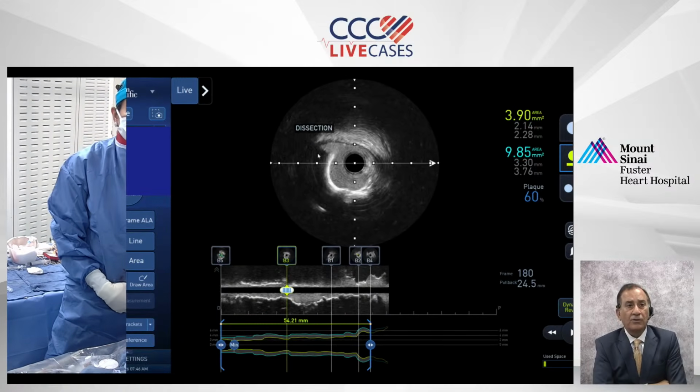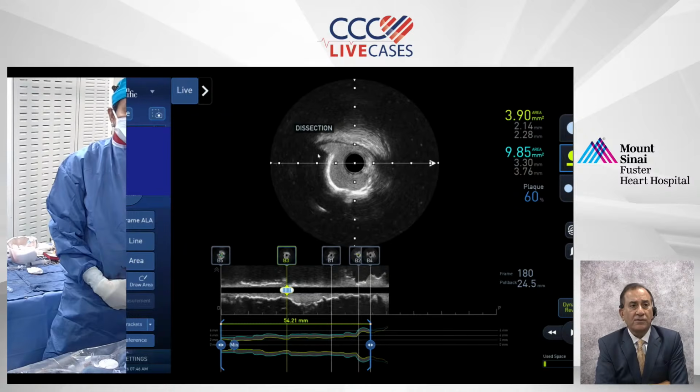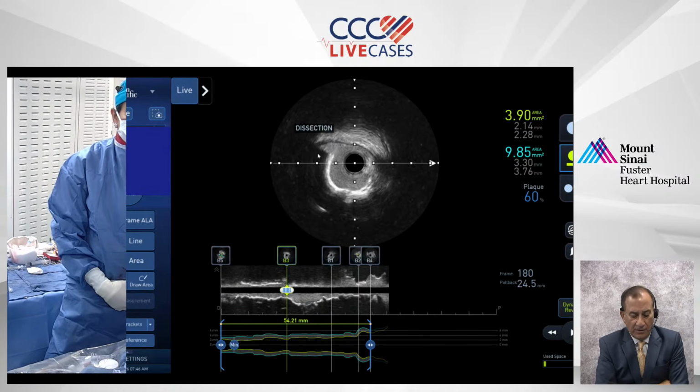I bet you observed it after 1,000 cases of IVL. Profound observation, hopefully very beneficial for the audience.